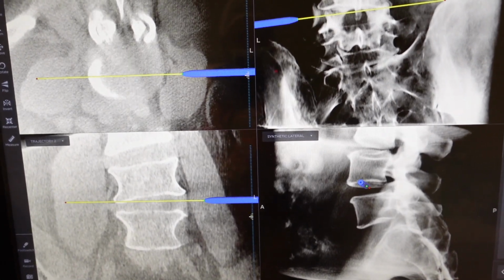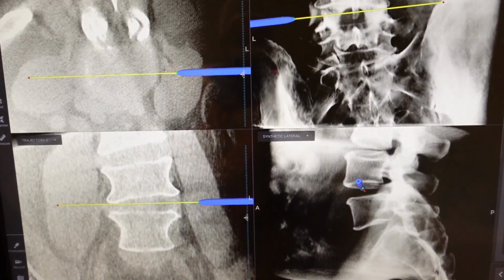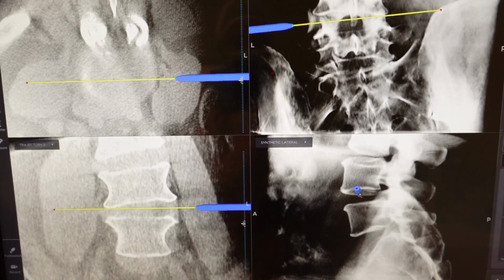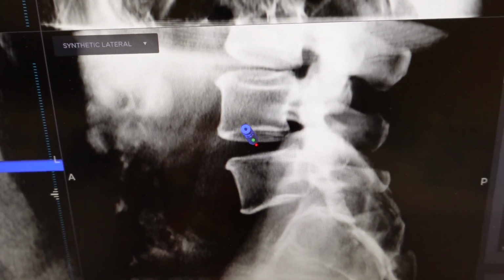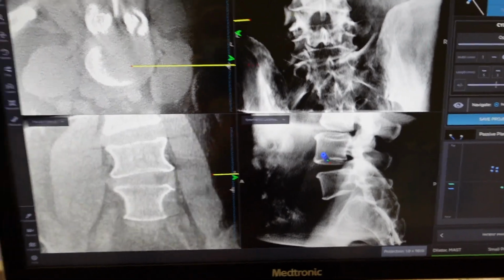All right, I've got the navigation system going. I've got the initial retractor in. I'm doing shallow docking. And look at this, it's cheating. I got it set perfectly. Lock that down. Now I'm going to look down there, expose the psoas, and dissect through the psoas under direct vision. Hence the name direct look technique.